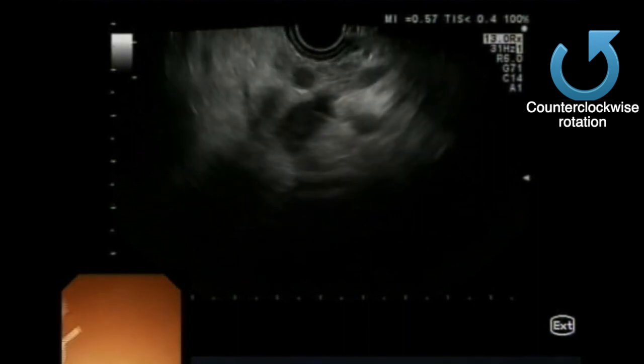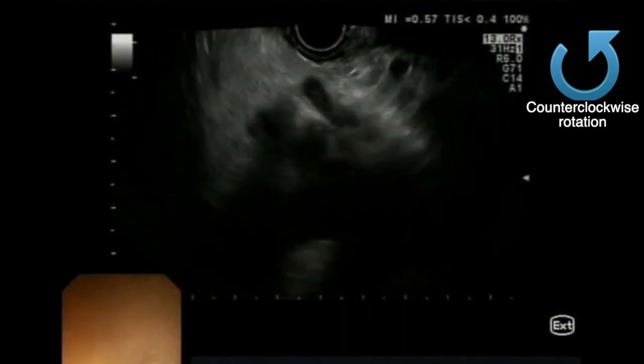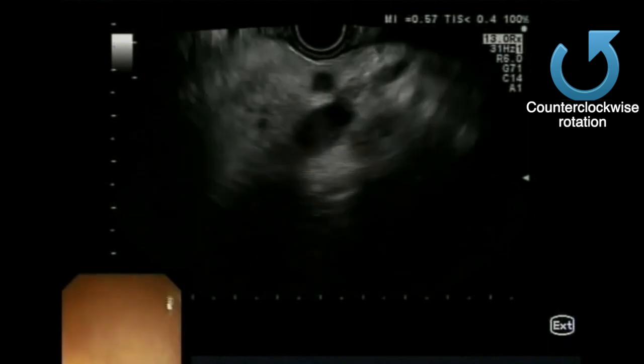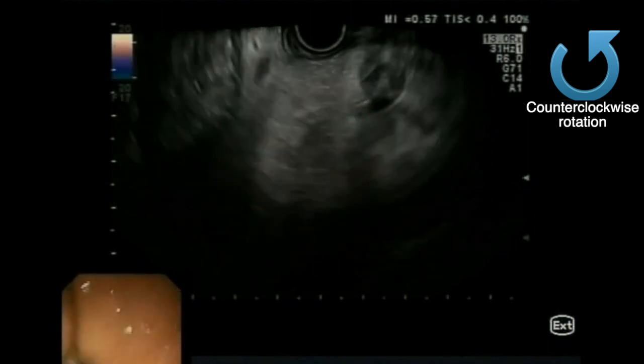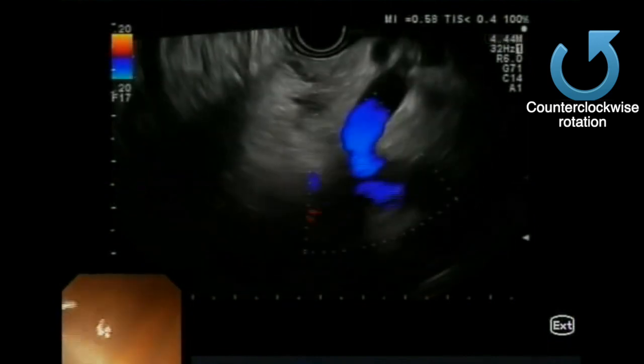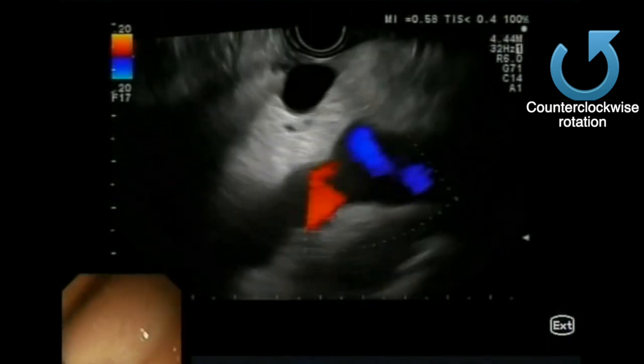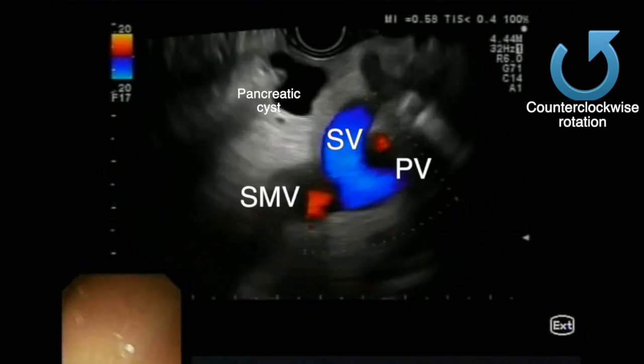If we advance the scope further and release the up-down wheel, the neck of the pancreas comes into view. By rotating counterclockwise, on the right side of the screen we can follow the splenic vein going down to the portal vein into the portal confluence.